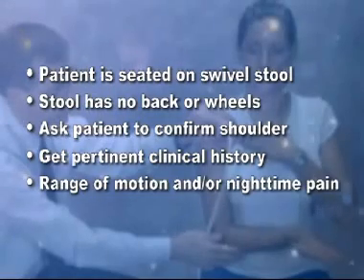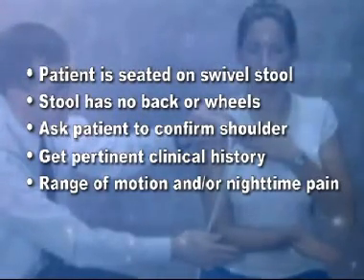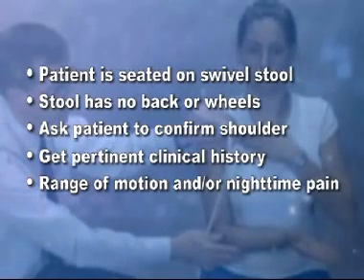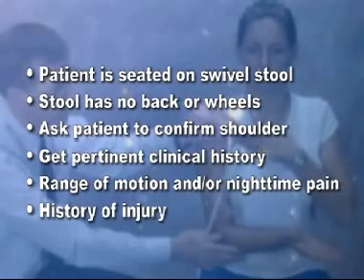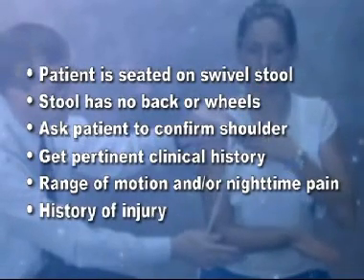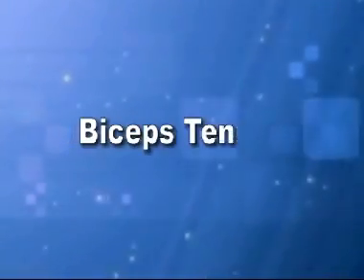The patient is asked if they have limited range of motion or, in the event of pain, does the pain wake them up at night. The patient is also asked if the current condition is a result of an injury, and if so, how long ago the injury occurred.